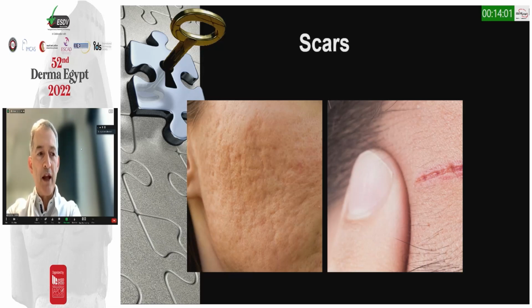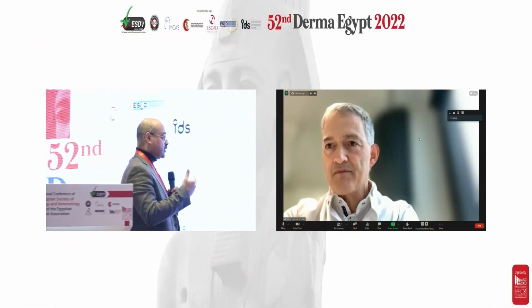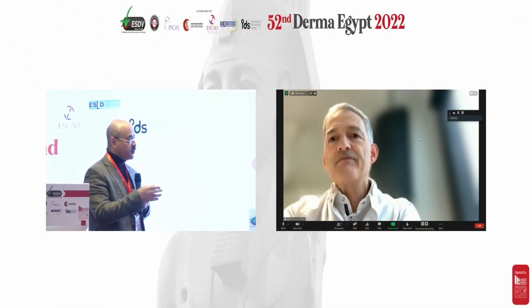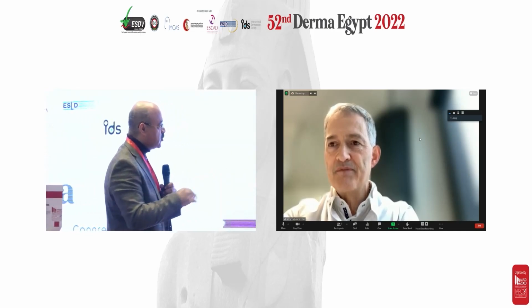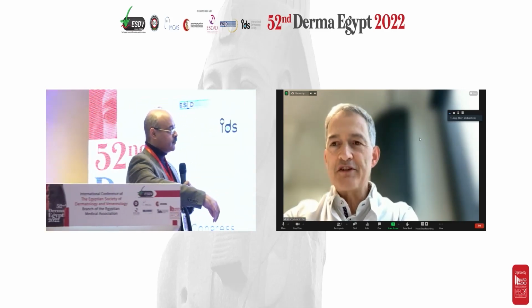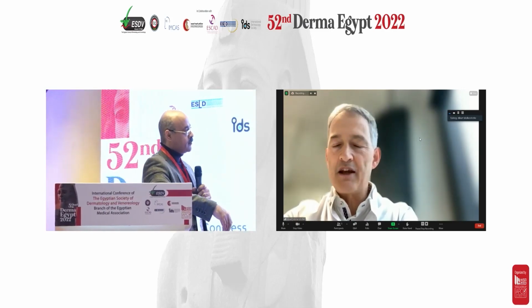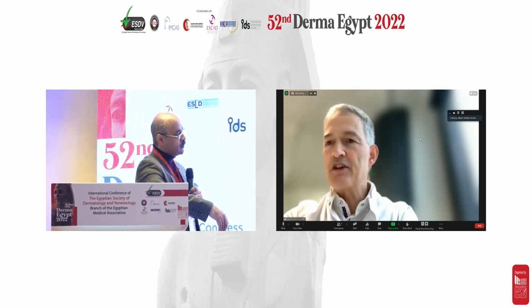I typically wait until I see how the scar is going to look, and then I will start the treatment depending on the type of scar, with different devices. Okay, so the strategy of using the pulsed dye laser within 7 or 10 days after the operation or at the day of removing the suture, which was published a long time back, this is something you don't do? You don't recommend it? I only do that in very special cases where I know that they get hypertrophic scars, where they had that in the past, and where I can treat very early.